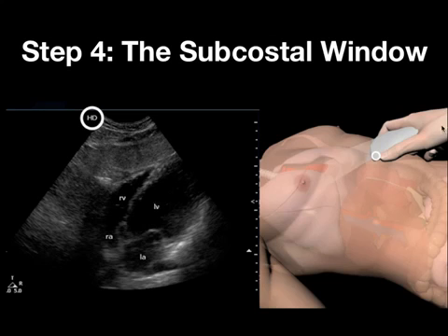You can see here that the hand is held on top of the transducer. You don't want to keep your hand underneath the transducer, since that will force you to basically bury your fist into the patient's abdomen in order to get this window. And patients who have either blunt or penetrating injury there are not going to appreciate that deep amount of pressure.